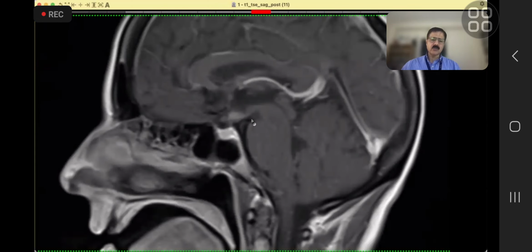To call it a glioma was fine, but that was in isolation. So there were too many things which were happening. It was a difficult one. It's too what we call complex for a viva situation.